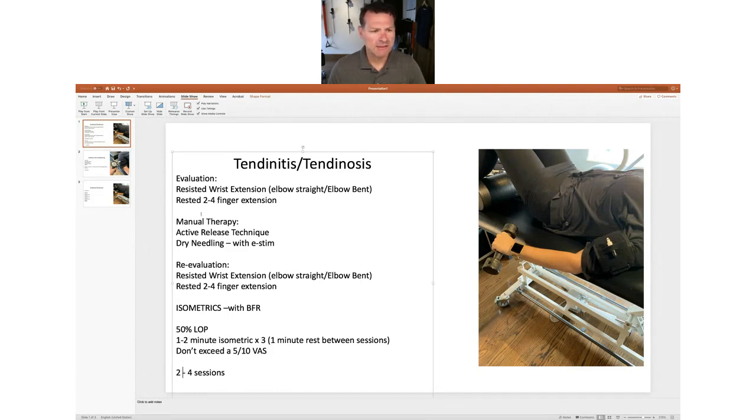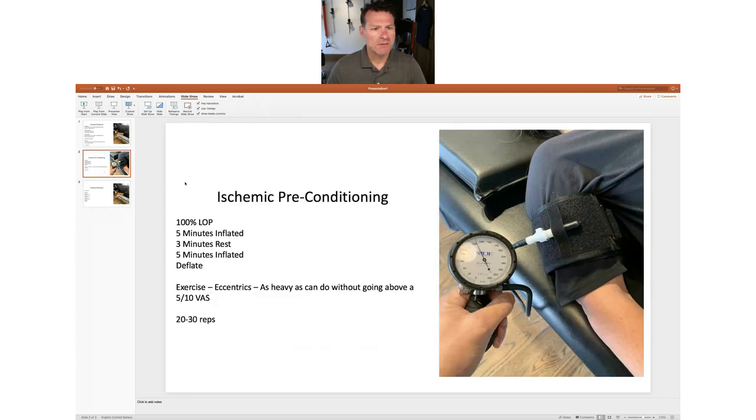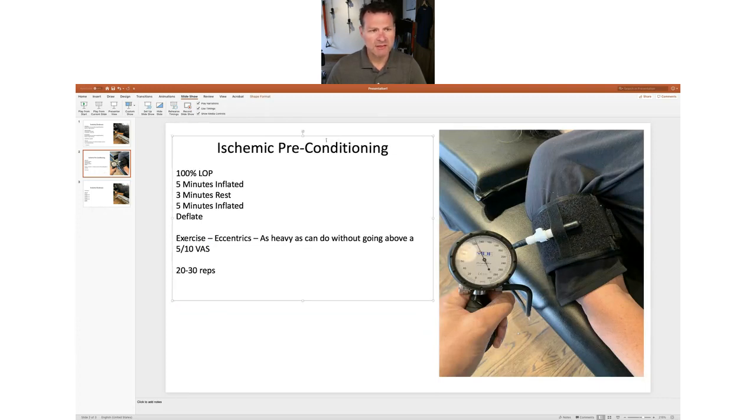Okay, so then what I might do next is I'm going to cut and paste this because I'm going to need this. Copy. Now I'm going to use something called ischemic preconditioning. And ischemic preconditioning is 100% limb occlusion pressure, 5 minutes inflated, 3 minutes of rest, 5 minutes inflated, and then I'm going to deflate. And then I'm going to do exercise, and the exercises are going to be eccentrics without the cuff.